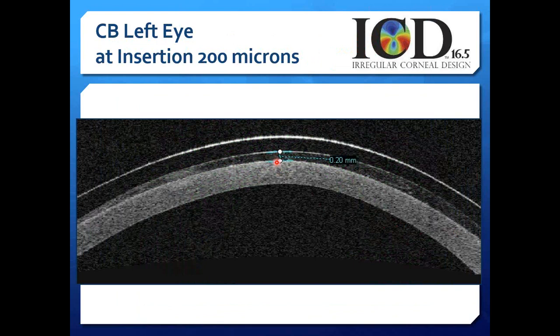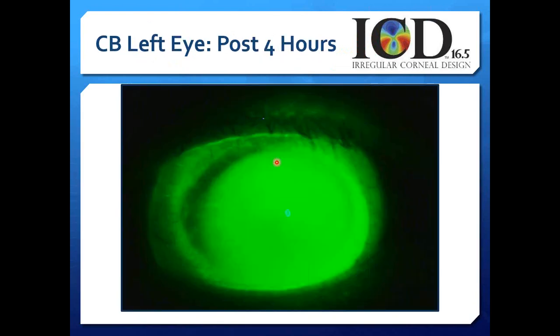So the depth of this eye must have been much lower than we anticipated, because even with a lens that was far too low for this eye in theory, we still ended up with some fluid between lens and cornea. Probably the minimum amount of fluid we'd be comfortable with on insertion. If we had under 200 microns of fluid on insertion, we should probably put in another trial lens, go up by 100 or 200 microns.